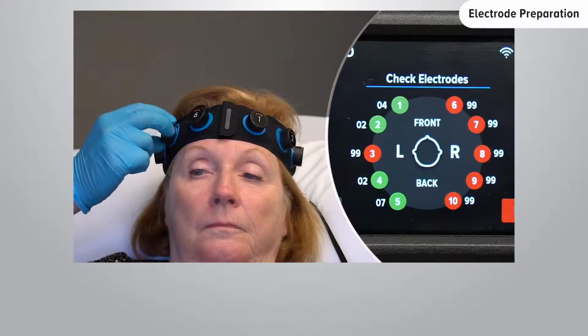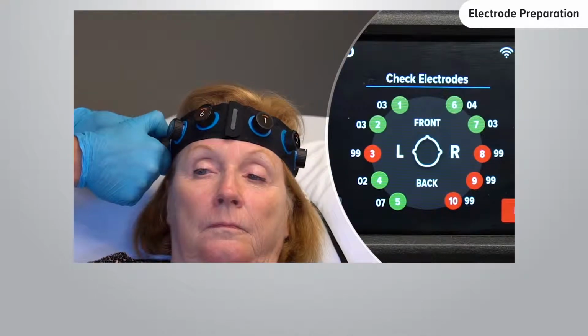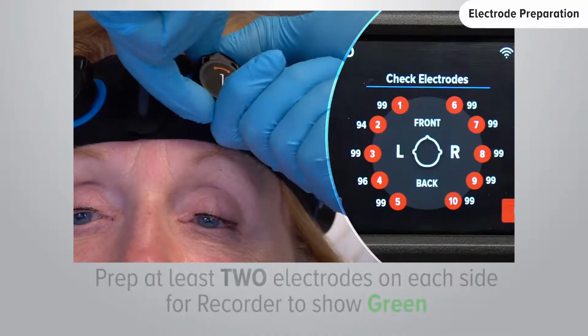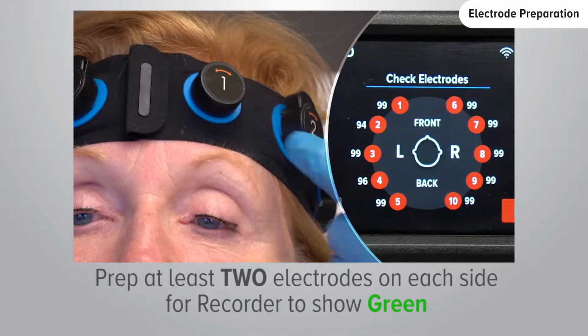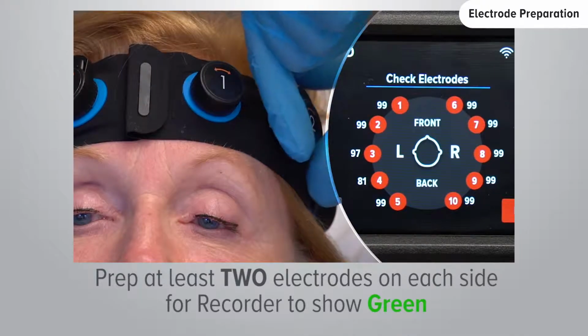Once all 10 electrodes have been prepped, check the device for the electrode connection status. If an electrode connection is good, it will be displayed as green. Red indicates a poor connection. Note that you must prepare at least 2 electrodes on each side of the head in order to get connection status readings.